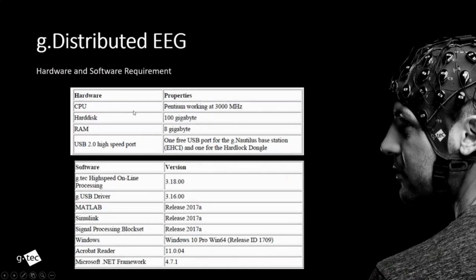So same as before, there are some requirements, and they are quite similar. As long as you can use the MATLAB interface, then you can use this function. It's also a Simulink toolbox, so make sure you have this driver here. The USBamp will be the required amplifier. I'm quite sure other amplifiers will work as well, because we're using the same g.NEEDaccess server, but we haven't tested yet. So in case you are interested, just let me know and I can check for you.